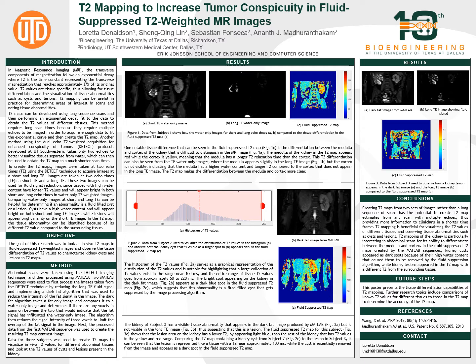Some possible obstacles related to MR images are artifacts caused by patient movement or metal implants, and there are algorithms that exist to try and suppress these issues, but since T2 maps are created from MRI, any significant signal discrepancies would also appear in the T2 map. Future steps to take in this area of research would be to compare T2 values in the T2 maps to already known T2 values from literature and see how they match up or if there are any common discrepancies.